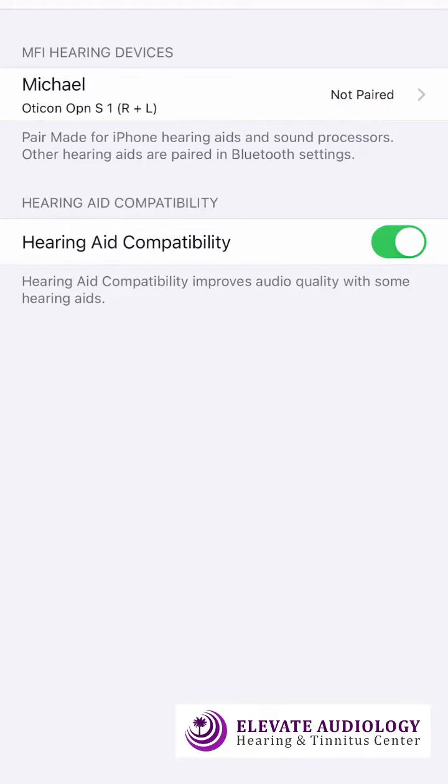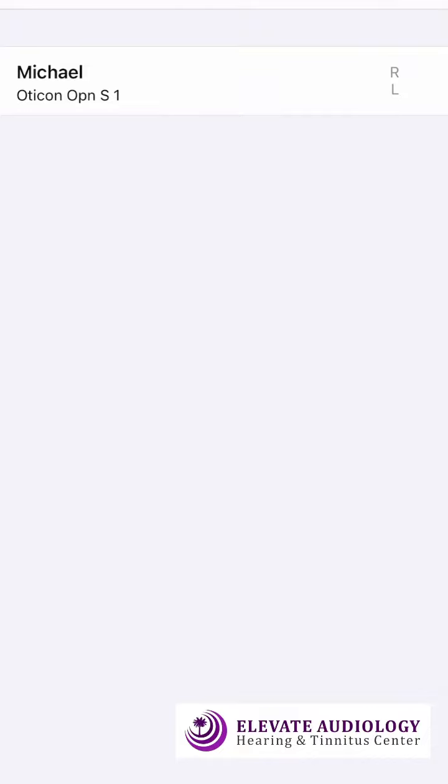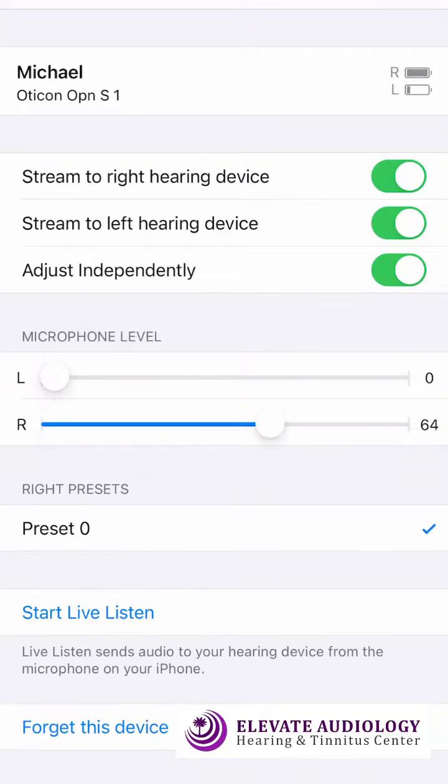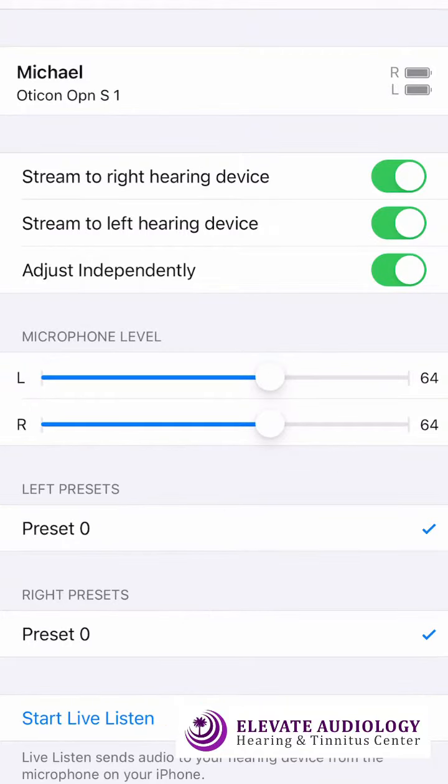Two little screens will pop up and it'll say pair or cancel. And you're going to want to hit the pair button twice. So we're going to pair. Now both of your hearing aids are streaming to your iPhone.